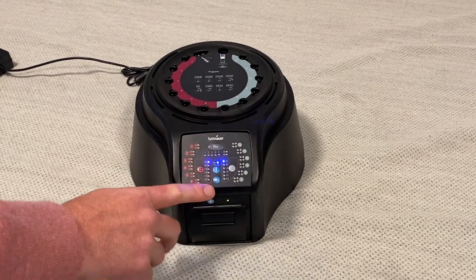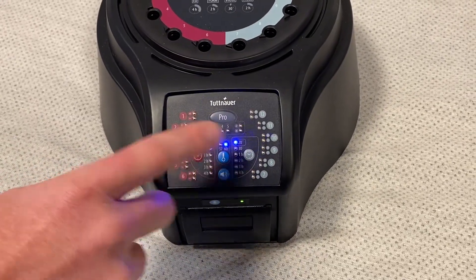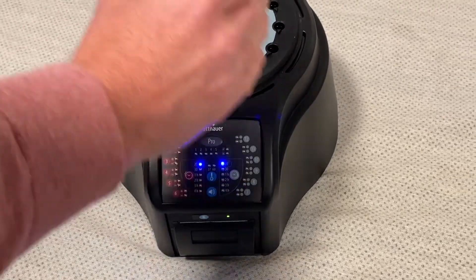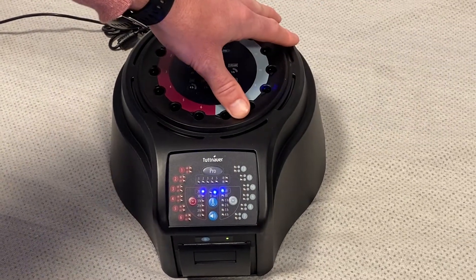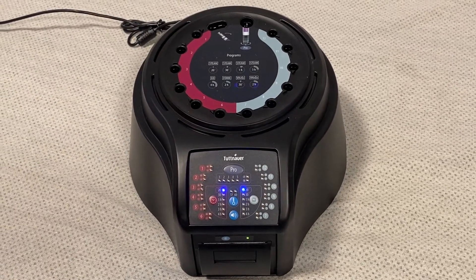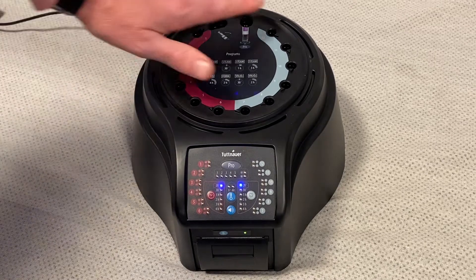As you can see, there is a main time for the left half of the reader and a main time for the right half of the indicator. I can run different times on each half. This is a 12-slot indicator, so I can be running six at one hour and six at 20-minute readers, depending on the biological indicator and the required time. You cannot run two different temperatures — there's only one temperature selection for the whole machine.